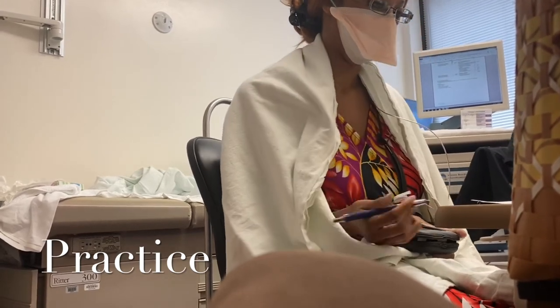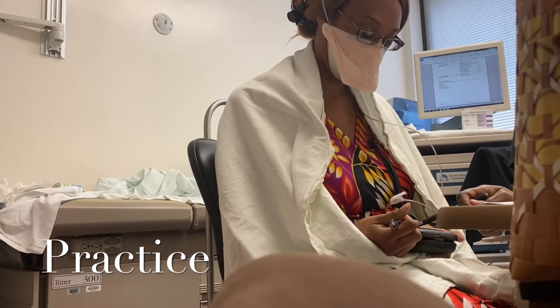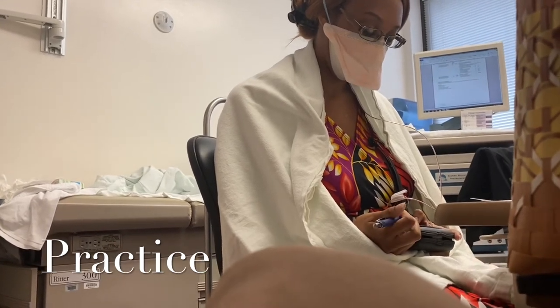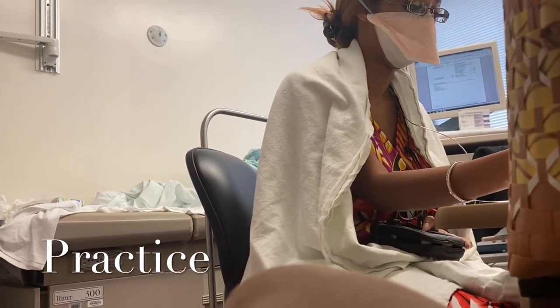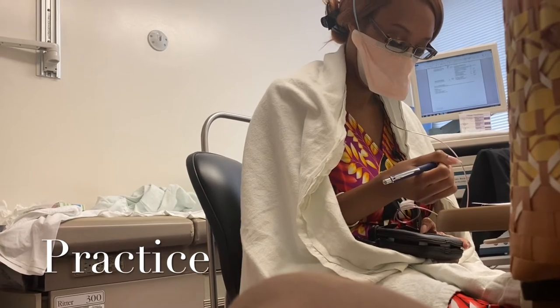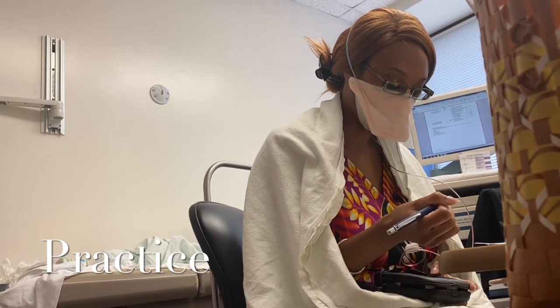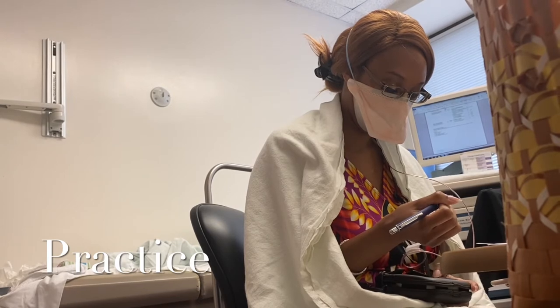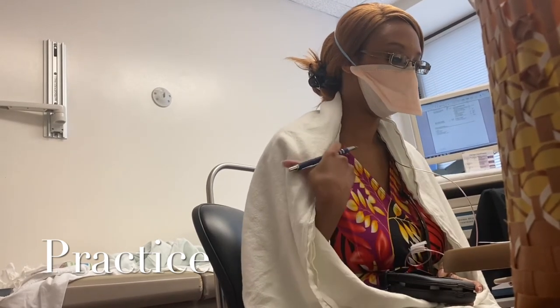Now let's practice lying down. This little guy means you're sitting or standing, because he's up. When you lie down, you'll please push this one. You see how he lays down? What time is it? 14:25. So put 14:25, and then you'll go over to lying down, in this case, put a check mark there, and you lie down. That's when you on purpose lie down to take a nap, to go to sleep. And when you get back up again, you push that button, since now he's got up again, and you write down the time you got up. So meals and lying down have two entries, the start of it and the end of it.